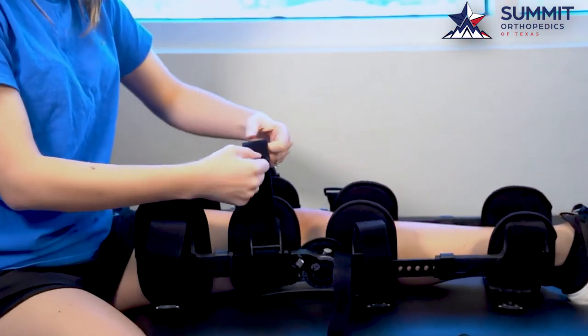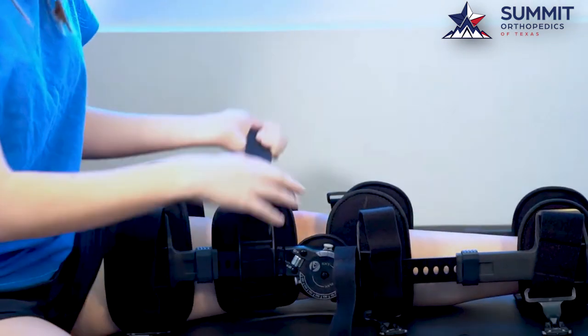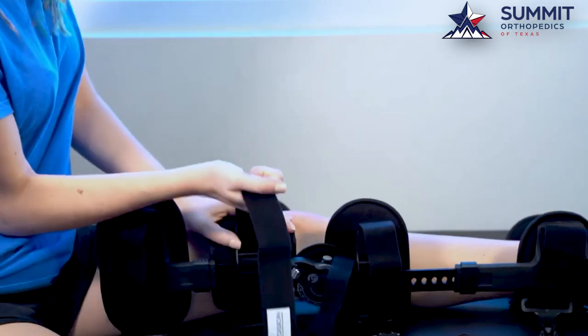If you need to adjust your strap, there's two ways to do it. You can pull from the top and adjust this way, or if you're noticing excess strap in the back, you simply pull it away from the Velcro and pull a little bit tighter.